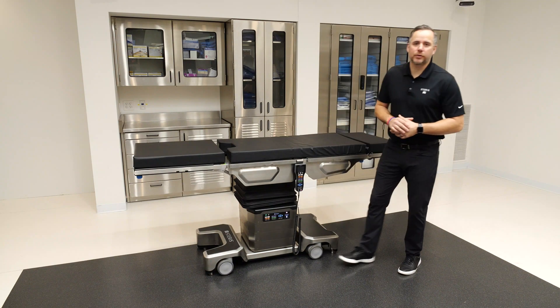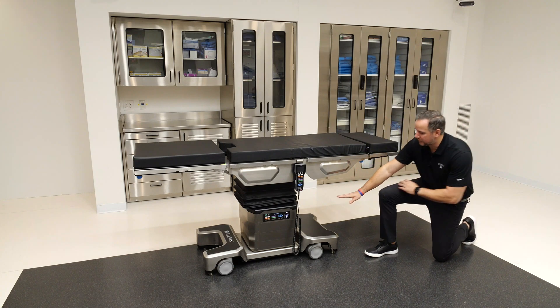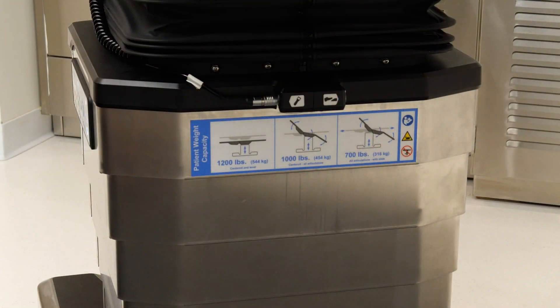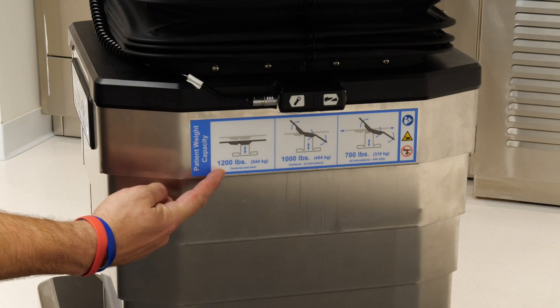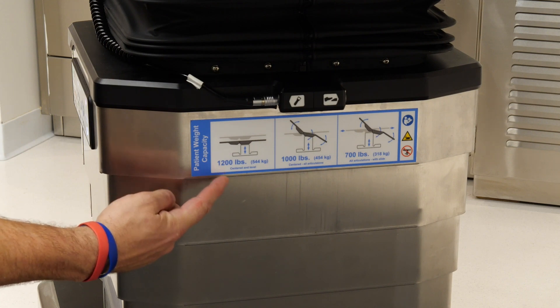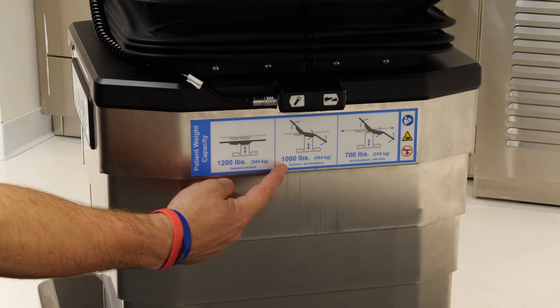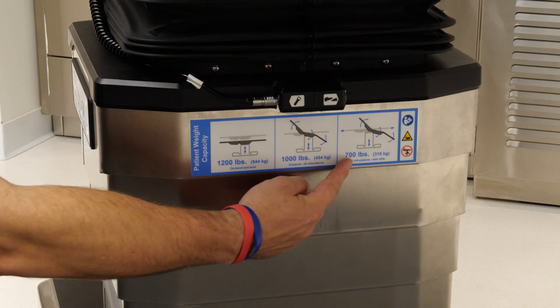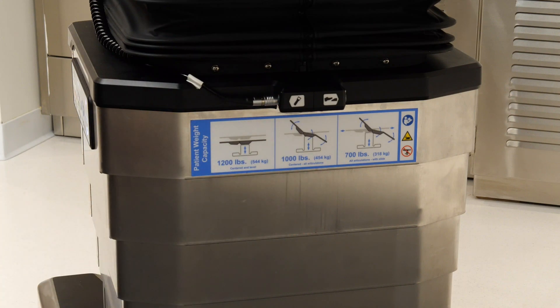The Steris 7080 general surgical table offers the largest weight capacity Steris has ever offered in a surgical table. If we look down at the base and column area, you'll see a convenience sticker located right here on the column that details all weight capacities for the 7080 model. Starting at the highest, we offer 1200 pounds of raise and lower when the slide is centered, in normal orientation only. Next, we offer 1000 pounds of articulation capability when the tabletop is centered, in normal or reverse patient orientation. Lastly, 700 pounds is the unrestricted weight capacity, meaning all articulations and tabletop slide are allowed in normal and reverse orientation.